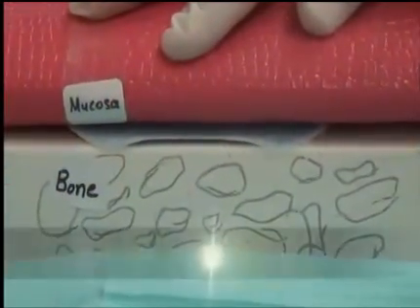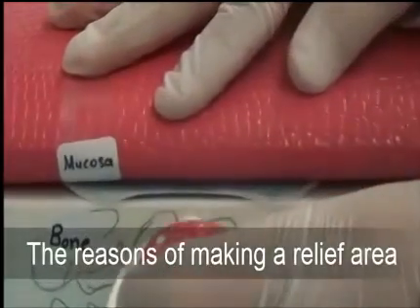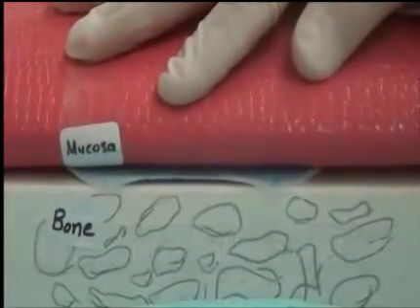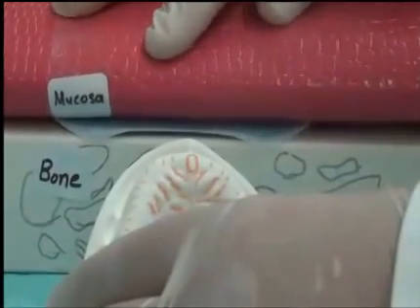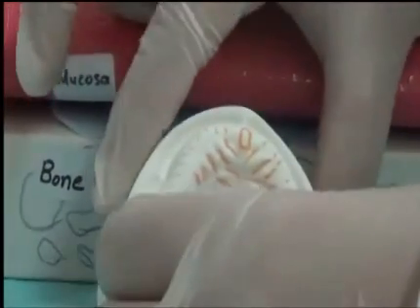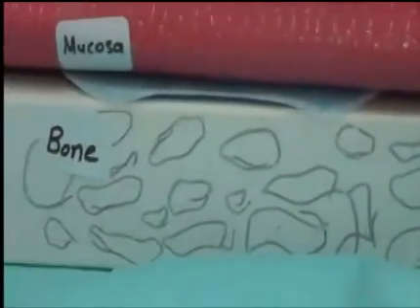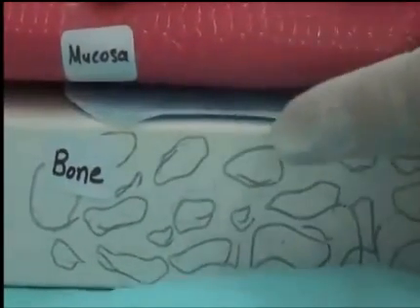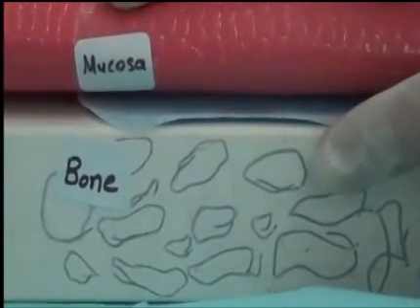Now we're going to review reasons why we need to relieve these areas using wax. The first reason is present in the following areas: around the tuberosities if they are bulbous, around the undercut areas, and in the mid-palatine raphe area. This reason is that underneath the mucosa, the submucosal layer is not as thick as in the other areas we have shown earlier.